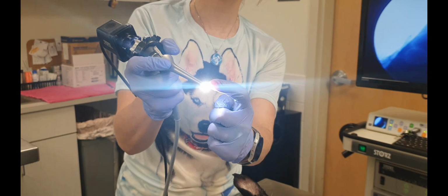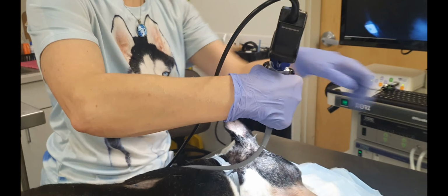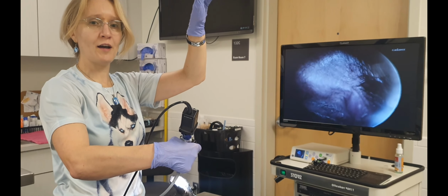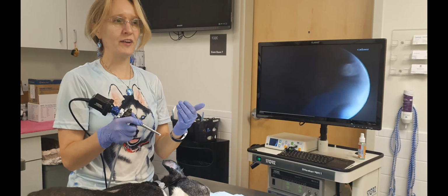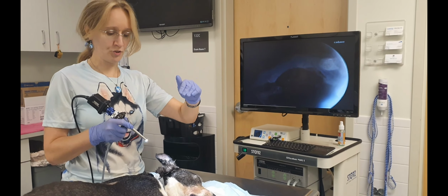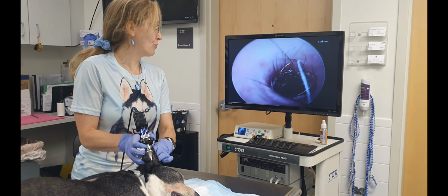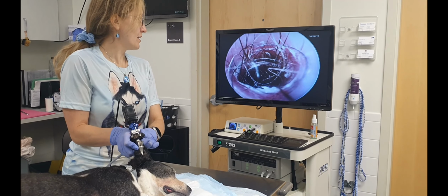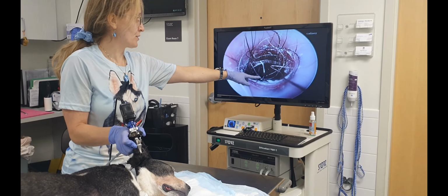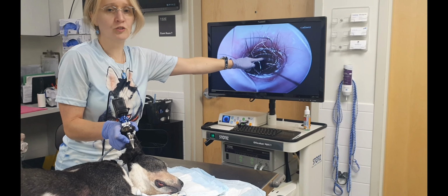Another benefit: if you look closer at the tip of the videootoscope, the operating opening is on the dorsal side of the videootoscope. So if you go this way, like normal, all the instruments will be pointing to the dorsal side of the eardrum, which is not typically what you need. Most procedures you need to do on the ventral part of the eardrum. So that position may help you, because, like here, this is the ventral part of the ear canal and this is the dorsal part, so your instrument will go on the top of that.